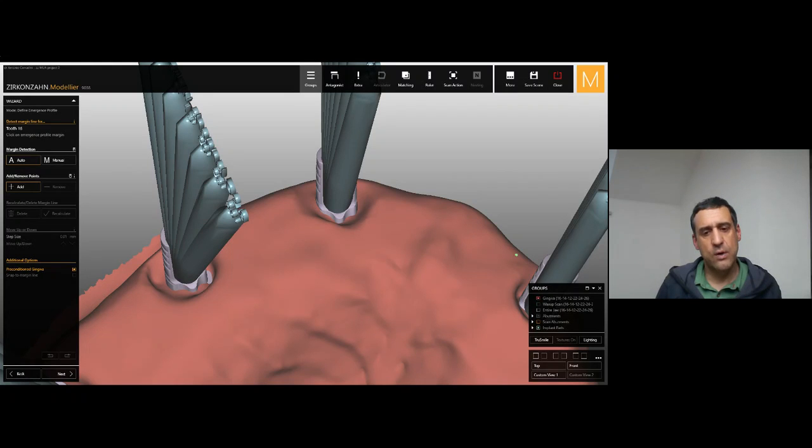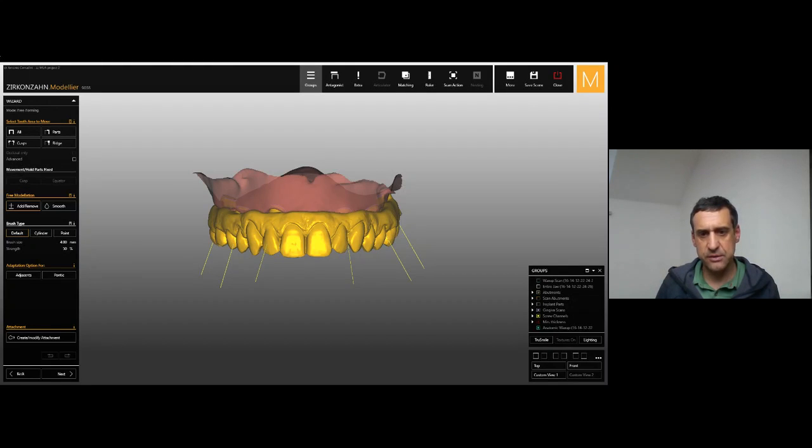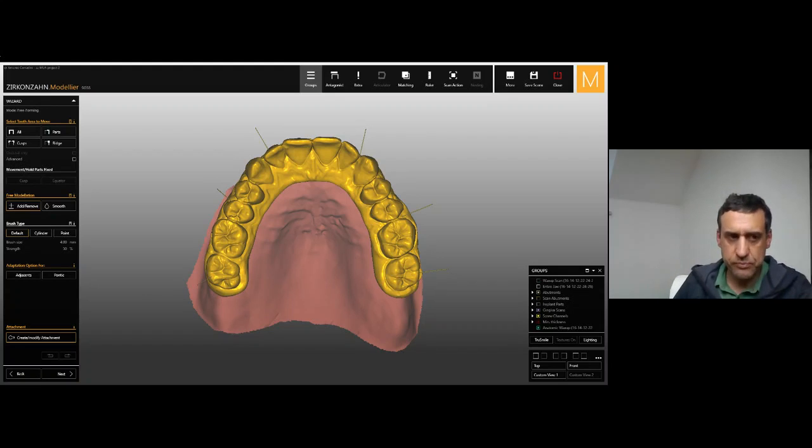And then once it's completely finished and the framework is merged, in the freeform module, this is our freeform, at the last step, we can choose attachment. And you can see this small channel screw is the original, let's say, channel screw. We choose attachment, and then in attachment, you have the option to align. I will show you in a few minutes.